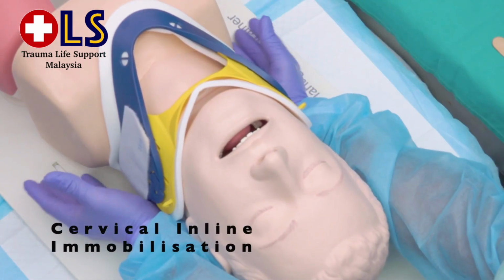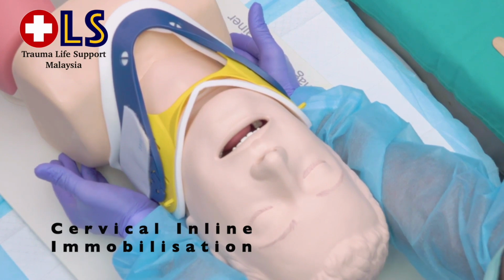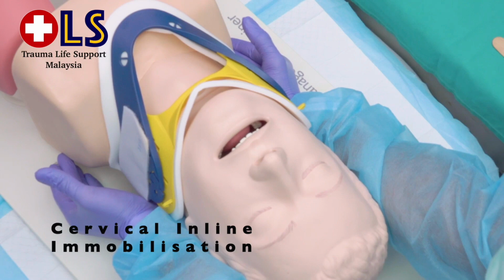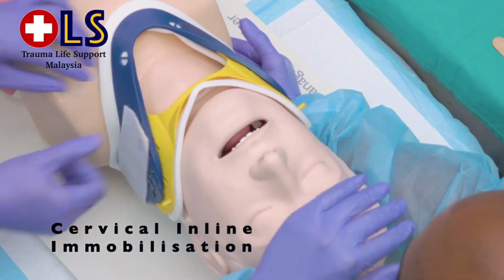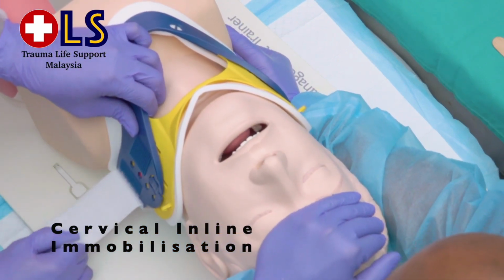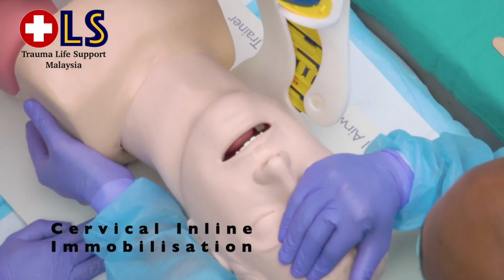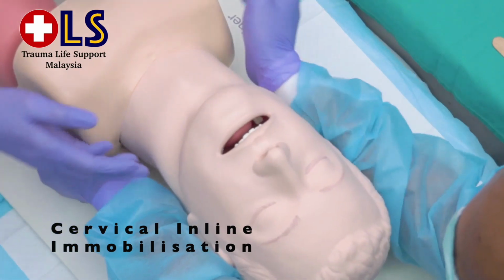This is inline immobilization. We would fix the patient's head and neck by gripping the forearms, your fingers at the back of the shoulder and your thumbs at the clavicle. You will require assistance from your second colleague to remove the cervical collar. I would change to here. Okay, remove the cervical collar. Okay. Mr. Nazri, kindly take over.